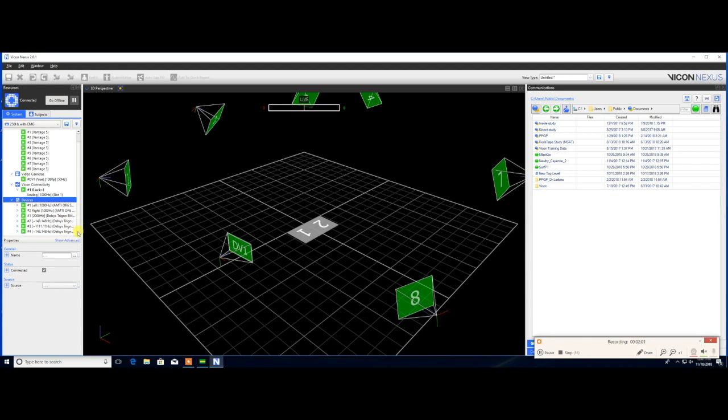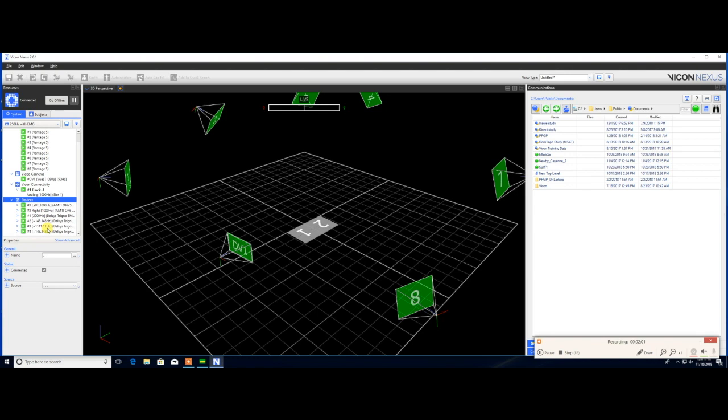There are a few things you should be aware of when using the Delsys Trigno System through Vicon. The first is simply to make sure that everything is plugged in and turned on. The second is to make sure that you open and start the Delsys control utility before attempting to collect data through Vicon. Lastly, while the Delsys Trigno System is optimized to avoid RF interference from most commercially available products, it is recommended that any unnecessary 2.4GHz sources be removed from the recording environment in order to ensure interference-free communication.